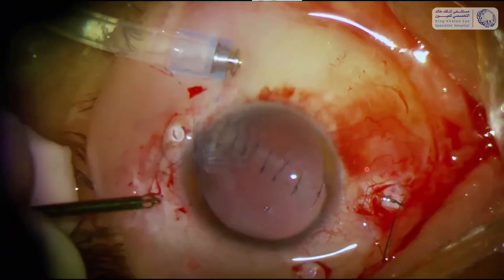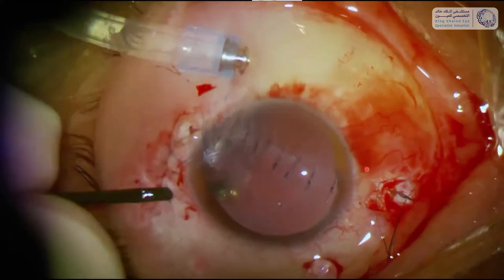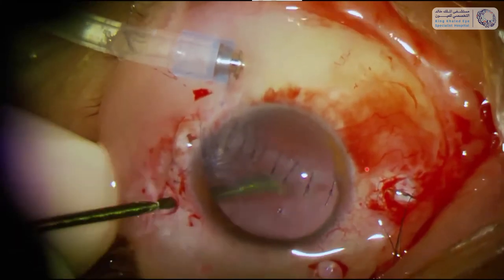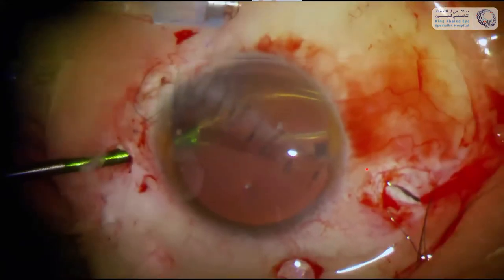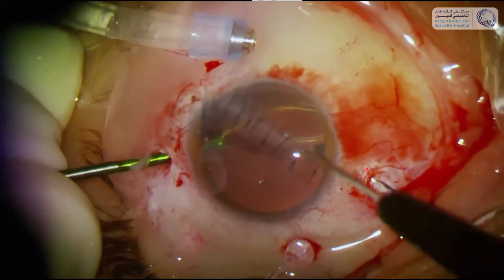The image is not so clear because we have blood floating around in the eye, and again I used this kidney stone extractor with the basket in order to grasp it, because I don't know of any other instrument that would be big enough to hold it. I opened it a lot more than in the previous case, using chandelier illumination and twin light, and a second instrument to bring the glass into the loop. The question was then how to extract it.